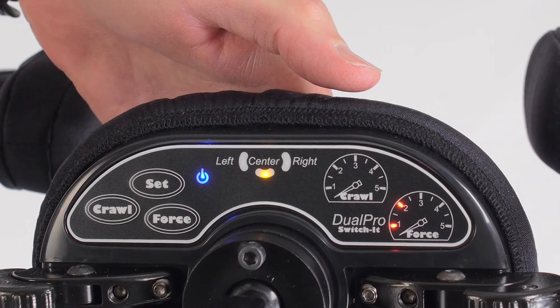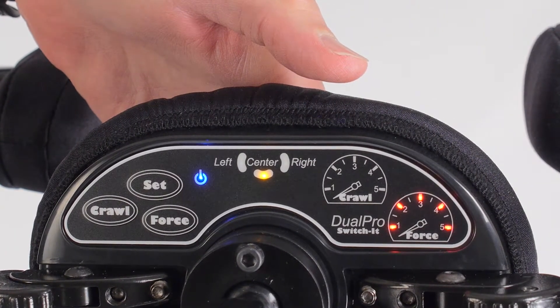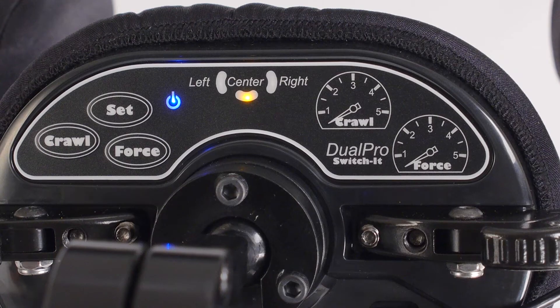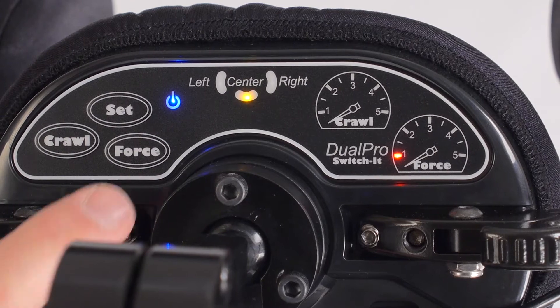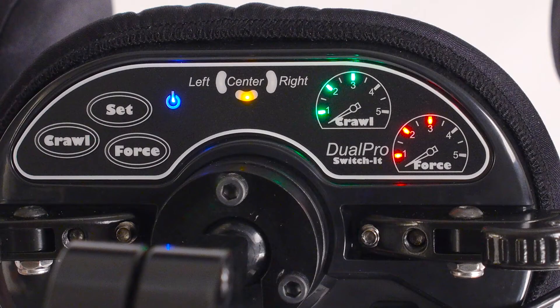Force is a measure of the user's head force against the sensor pad. As the force against the pad increases, the chair speed increases. If there are no lights in the force indicator, the force sensors are turned off. Each red indicator light equals the amount of force required to reach full speed. This is different than the proximity or Crawl lights, which represent a percentage of total speed.